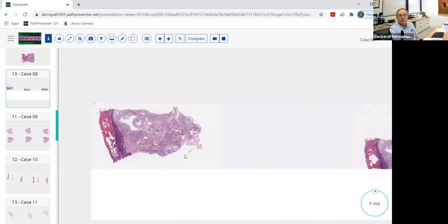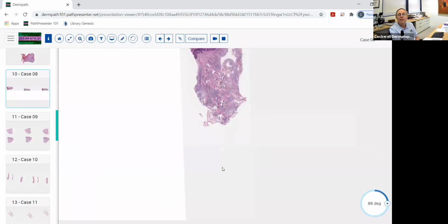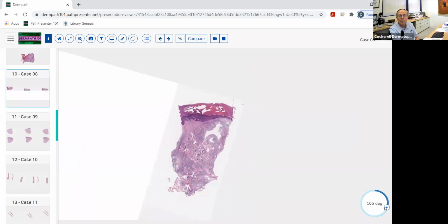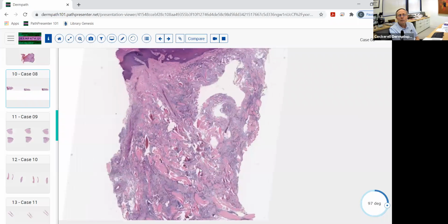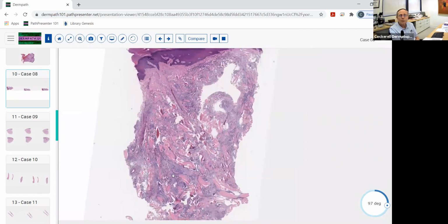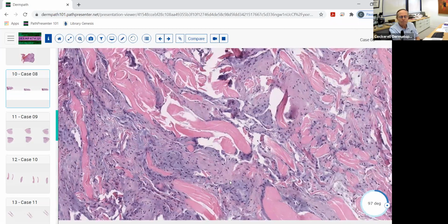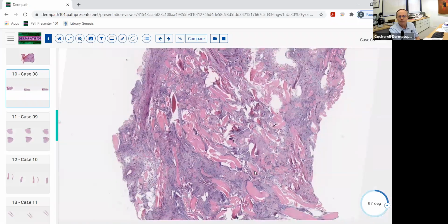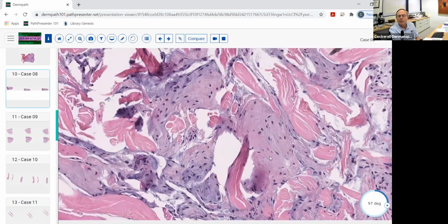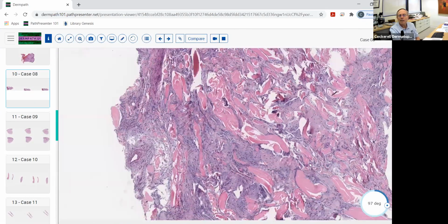Okay. Shifting gears now, we have a biopsy taken by punch technique, and it's from volar skin near the finger probably, and that's the most common location of these lesions. When you look at this lesion, notice it's a process that's going on in the dermis. So we're dealing with tissue involving fibroblasts, histiocytes, things of that nature in the dermis. And here we've got a lot of myxoid change to the lesion, okay? So this is an acral site. It's fibroblasts in here, perhaps some histiocytes, and it's got a lot of myxoid change to it.